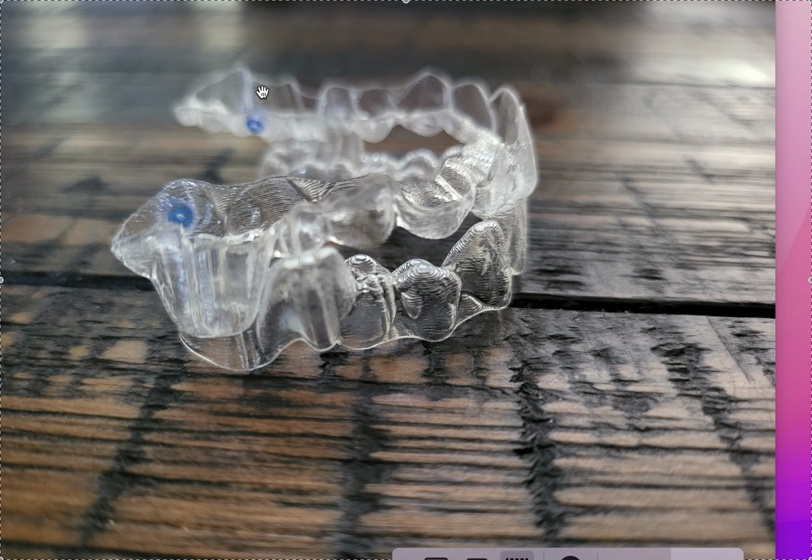Now, remember, Invisalign with MA is available in the comprehensive product. Comprehensive is normally done in slightly older kids, but you get 5 years to finish that case. In most countries, you could also do it with the Invisalign First product, but not all countries have Invisalign First. Now, my preference is to do the MA with Invisalign First.